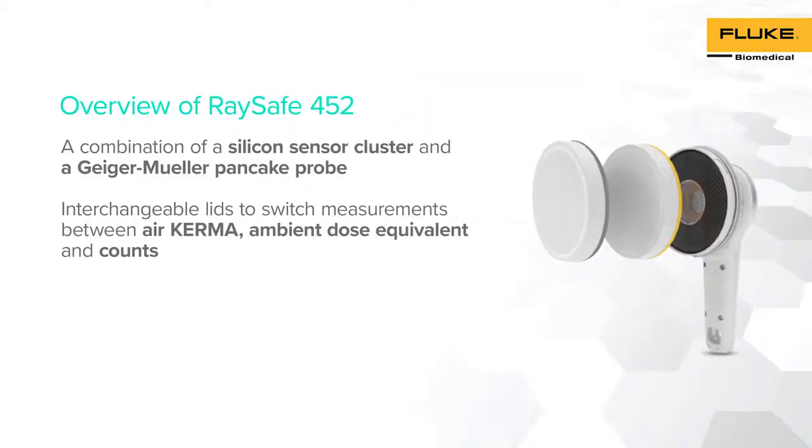RACE-A 452 consists of a combination of two types of survey meters: silicon diodes and a Geiger-Mueller pancake probe. This instrument has two interchangeable lids to switch between different modes, such as air kerma, ambient dose equivalent, and counts for alpha, beta, and gamma radiation.